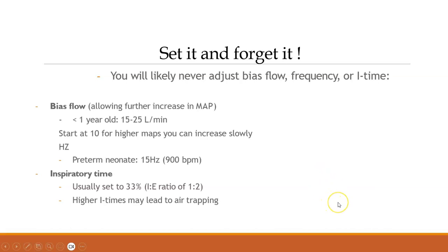Inspiratory time, 33%, which is our magic IE ratio of 1 to 2. Okay? I cannot think of a time where I did not have 33%. And this is in all ages. It's just simply not done.